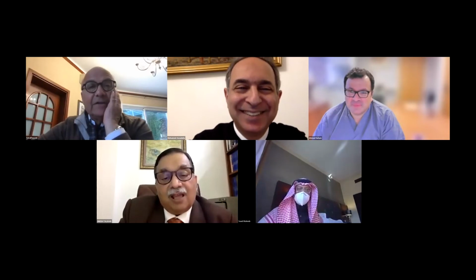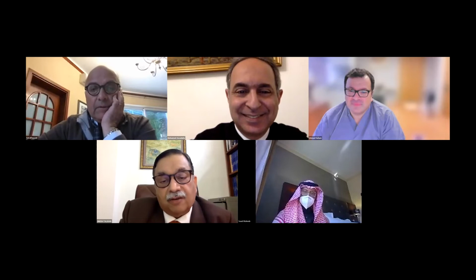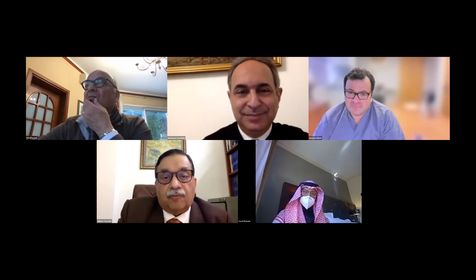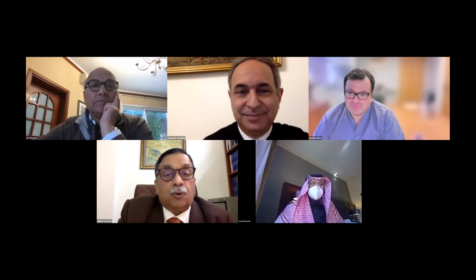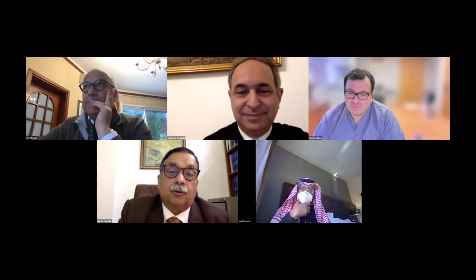Absolutely, even 5 minutes. Frankly speaking, I find no significant difference in the rate of emulsification. There is minimal difference, and 5000 is much more difficult to put in and remove. And you have to remove it anyway; I'm not thinking of leaving it forever. If I were thinking of leaving silicone oil forever, I might think of 5000. 5000 is more difficult to handle. If you overfill, you will definitely get glaucoma, so you have to be very careful when using 5000.